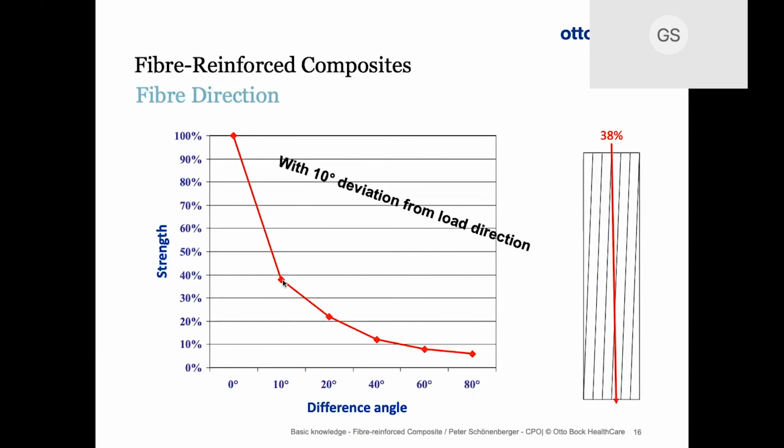So the thing is, with the great power of carbon, means that we actually have to dial in what we do as orthotists even more. We have to dial in not only what's happening in the sagittal plane, but also what's happening in the transverse and frontal plane accurately. If we're off just a little bit, if we don't understand gait with great detail, we can actually go in the wrong direction and not provide the patient what they need.